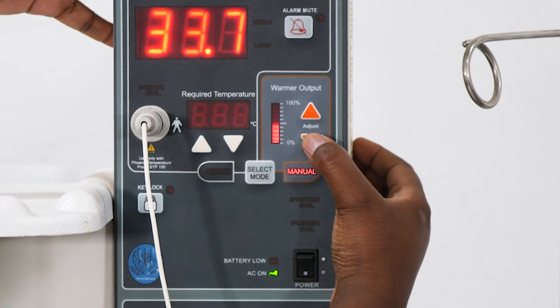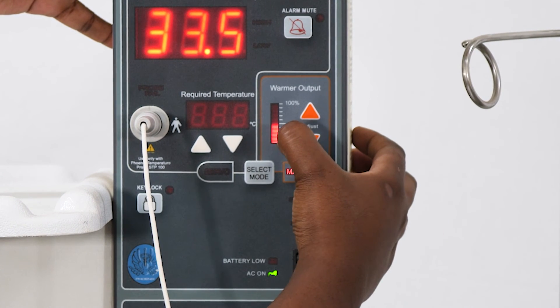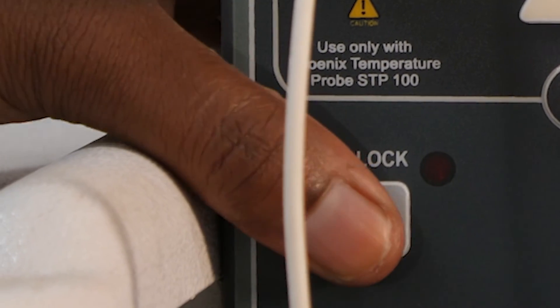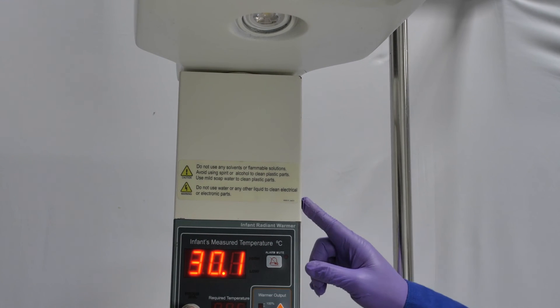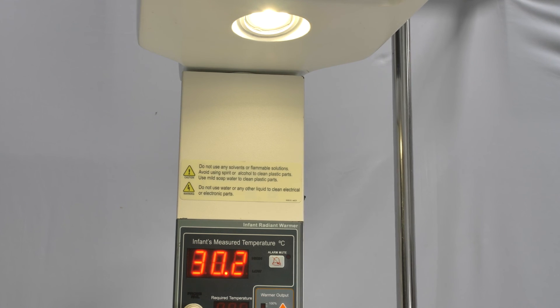It is currently halfway up the bar at 50%. You can also lock it. Finally, there is another switch on the side of the machine. This is to turn on the observation lamp.